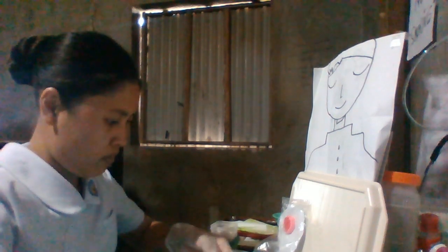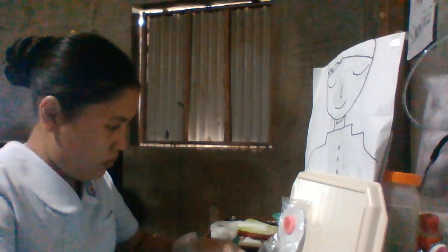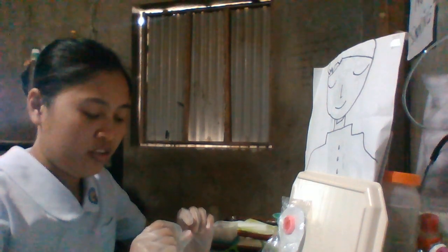And after securing it, we can dispose of the old colostomy pouch that we removed earlier in an appropriate trash bin. Then we can remove the gloves and do hand hygiene.